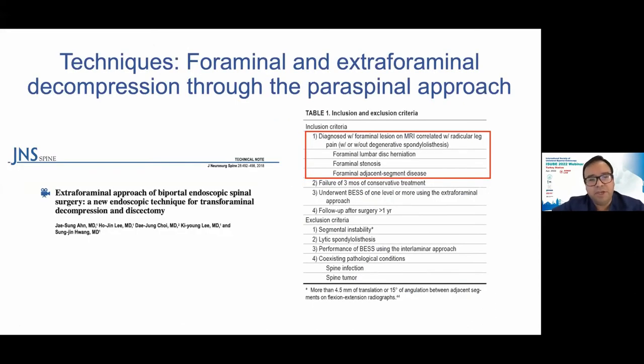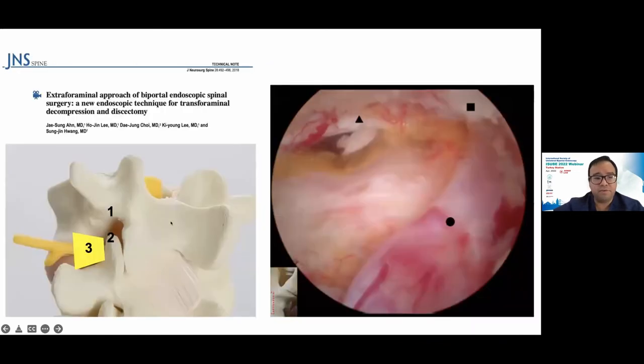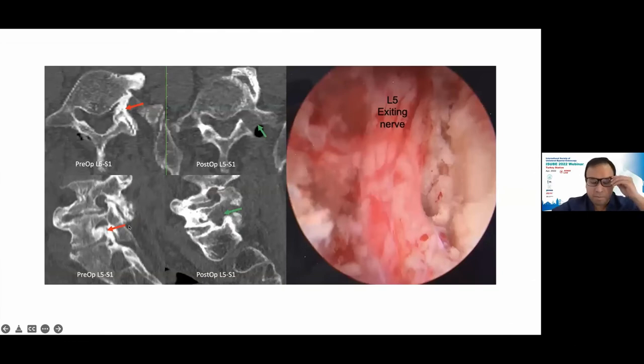Another thing that you can perform with UBE is the foraminal and extraforaminal decompression through a paraspinal approach. The paraspinal approach is different from the paramedian. The paraspinal approach uses the route that Wilse has reported in recent years, and you can reach the extraforaminal area and the foraminal area through this route, especially for pathologies of the foramen and the lateral recess. If you go more medially, you can see here the traversing nerve, the exiting nerve and the disc.